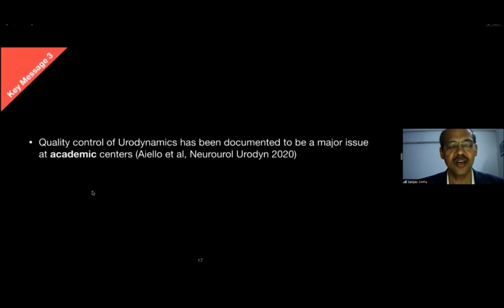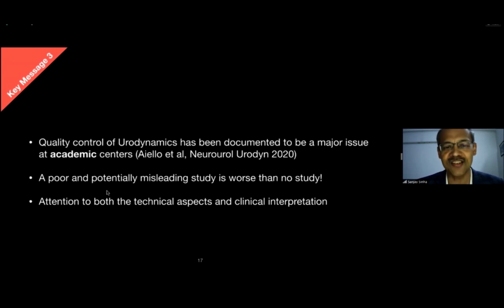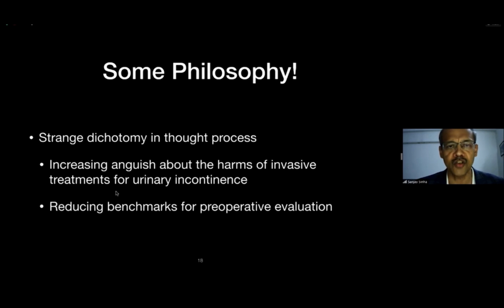So my last key message of the day is with regard to quality. There are clear problems with quality control in urodynamics, even across the best of the academic centers. It's very important to give enough detail to the technical aspects and the clinical interpretation of the urodynamics.